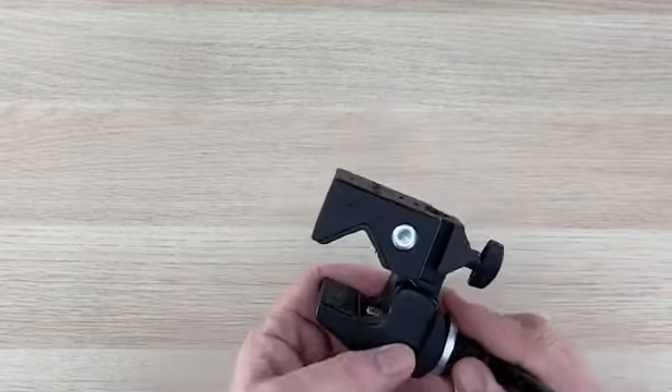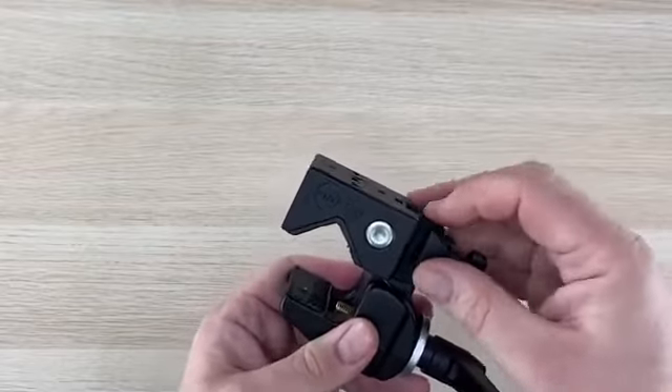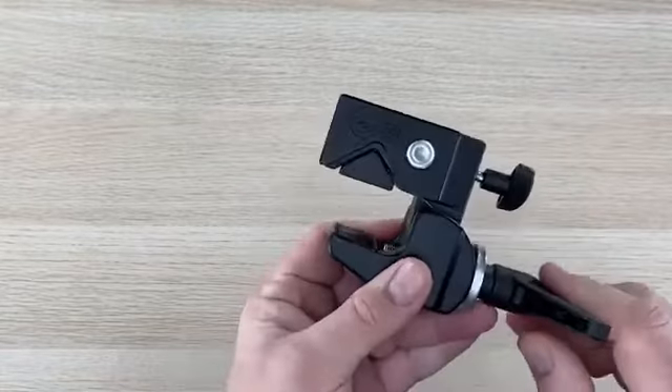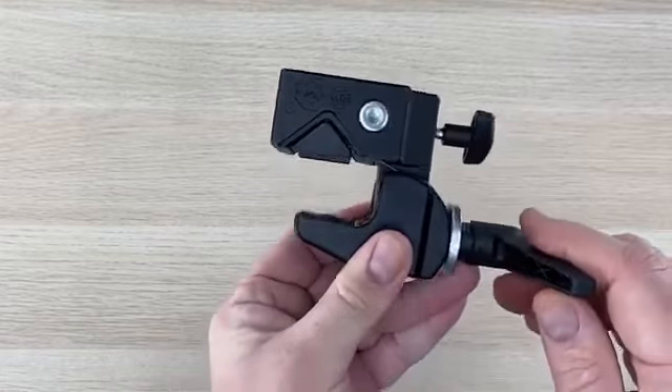Another way the super clamp can be used is on a table. Unscrew the T-nut a little bit, pull the wedge out, put the wedge in the seat portion, and now it has squared up so you'll be able to use it with a table.